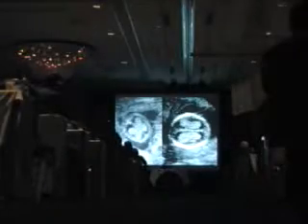Early on, at about 7 to 8.5 weeks, which is when this was taken, you can see the developing brain has a cystic area, particularly in the back there, the rhombencephalon. This is a normal part of development. Don't try to call this a Dandy-Walker abnormality. This is a normal part of development of the posterior fossa.